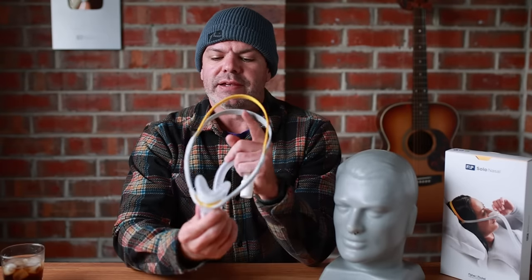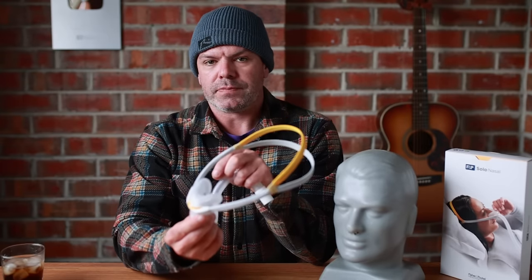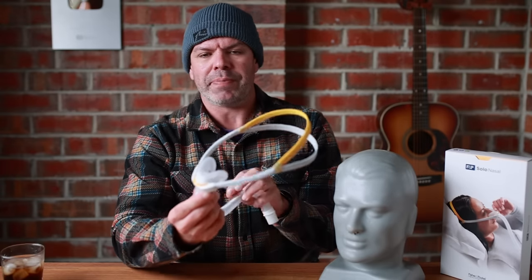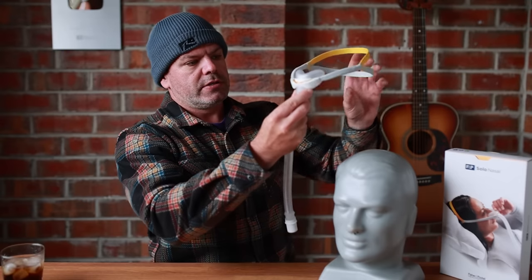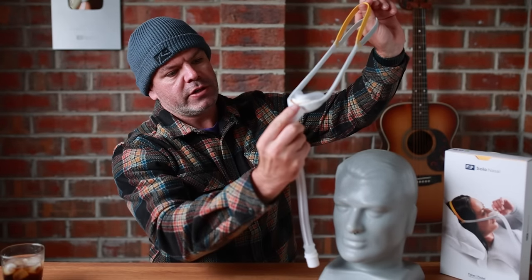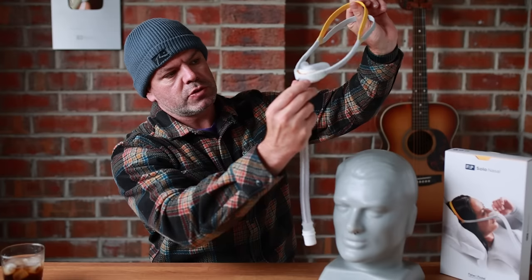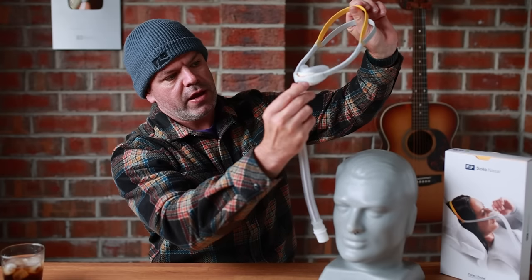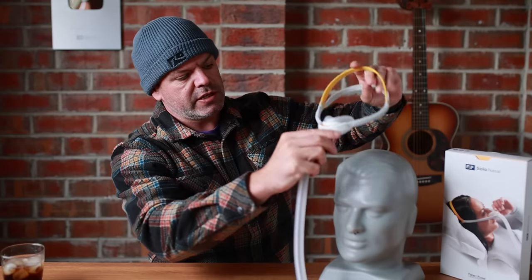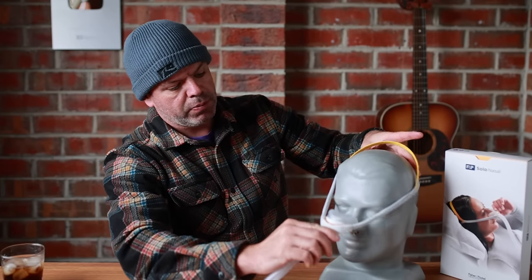Let me try and explain exactly what's going on. I used an analogy — it's like a soft closing drawer — but that's a terrible analogy. It's more like a seatbelt in some respects. So when you pull it like this, if I let go of the tension, you can see it's sort of elastic, sort of like that. That's pretty normal.